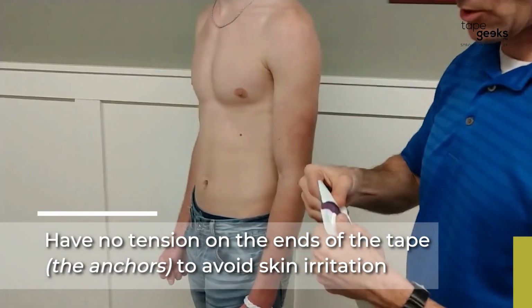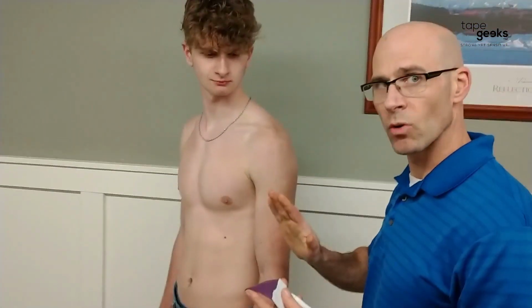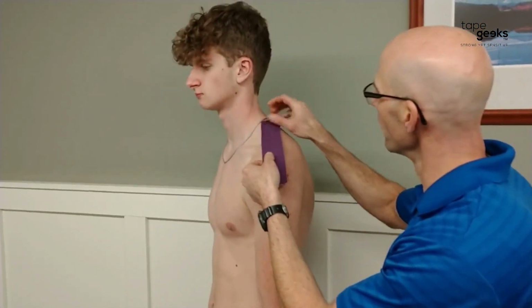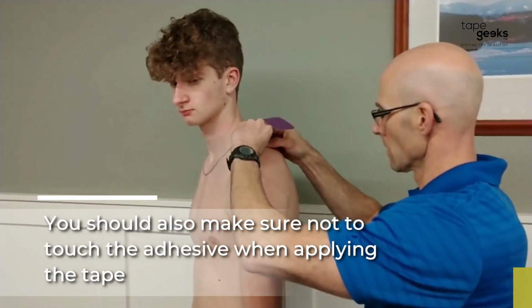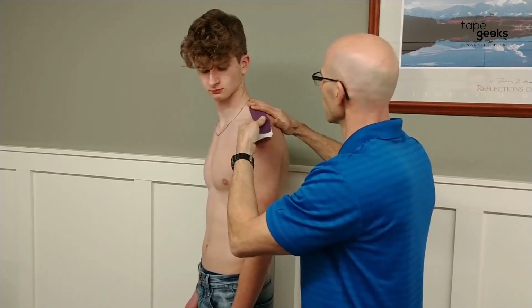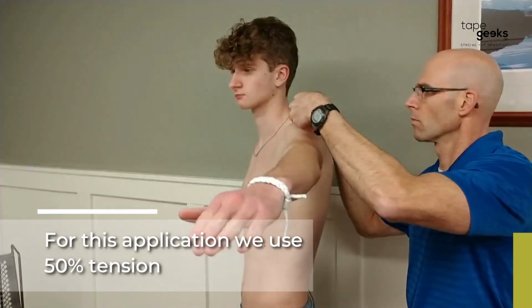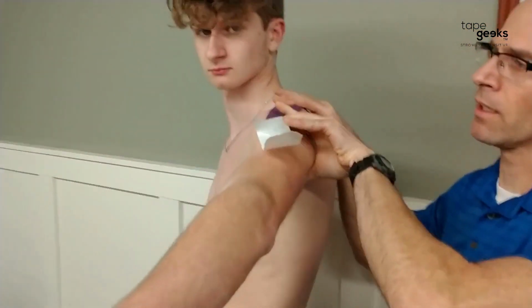In previous videos I mentioned the base or the anchors of the tape, where you begin and where you end, you have no tension on, because we don't want to cause any skin irritation. So we're going to put this right up here. No tension. Okay, lay that down. This tape comes in all kinds of colors, but my favorite color is purple, so that's what we're using. Alright, so we're going to raise your arm up, about there. So I put about 50% tension on this tape for this particular one. Now see, I don't have any tension on this. I haven't laid that down yet. I'm just holding it in place.